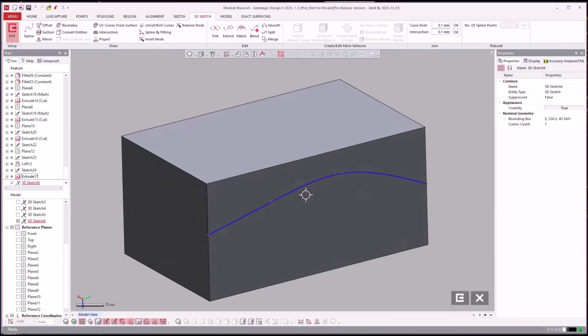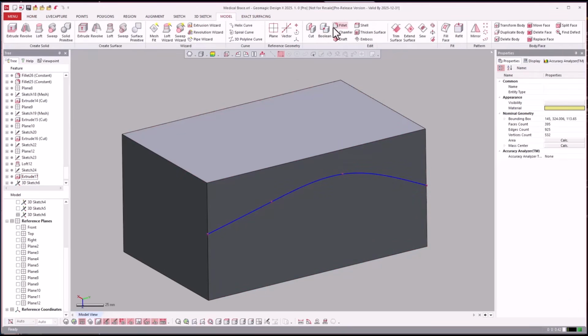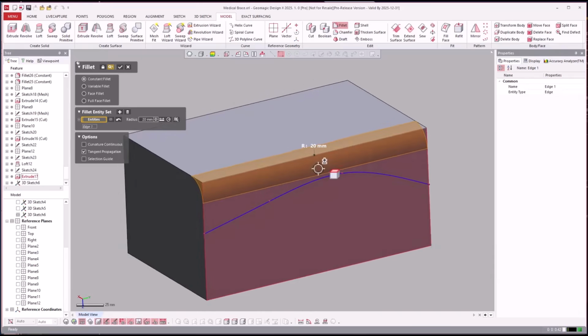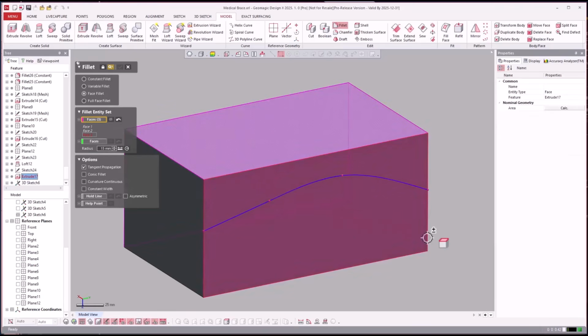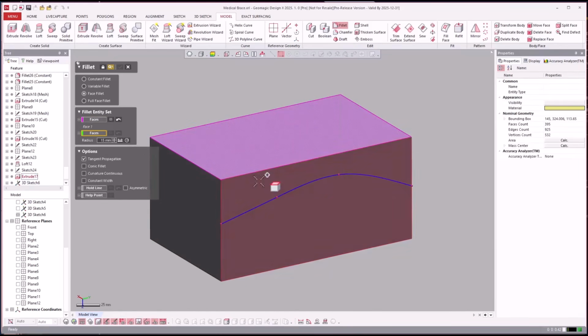So I drew an arc there. Get out of it. I'm going to come over to fillet, and you can grab your fillet and type in, there's your fillet. Awesome. But if you clear this out and do a face fillet, and clear that out because I clicked on the wrong one, I just want the other.